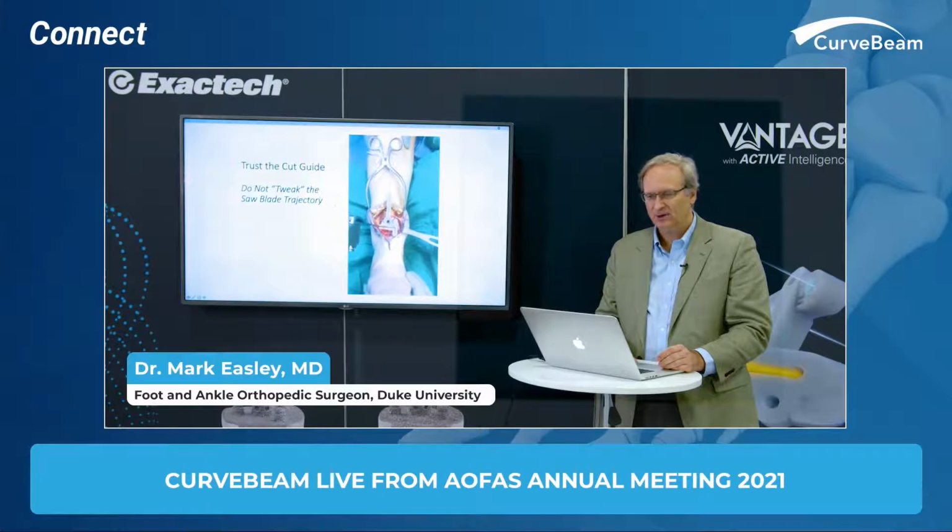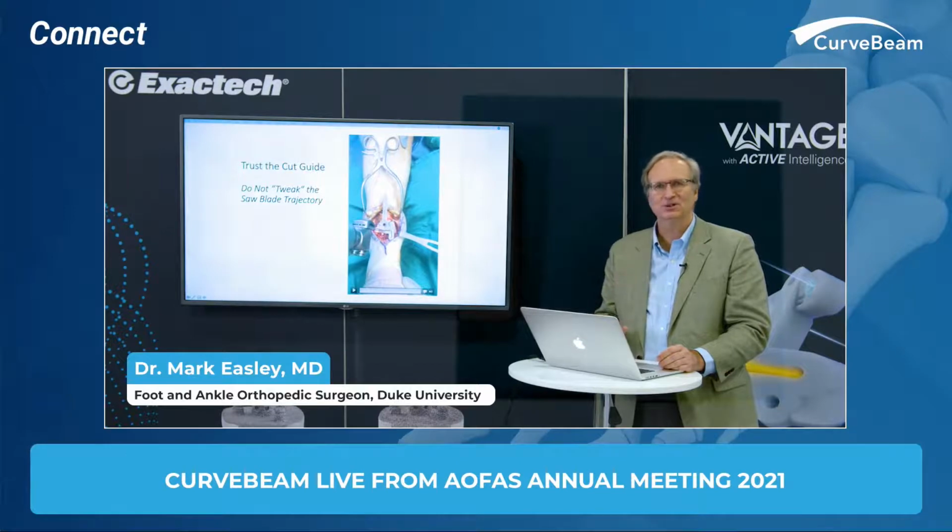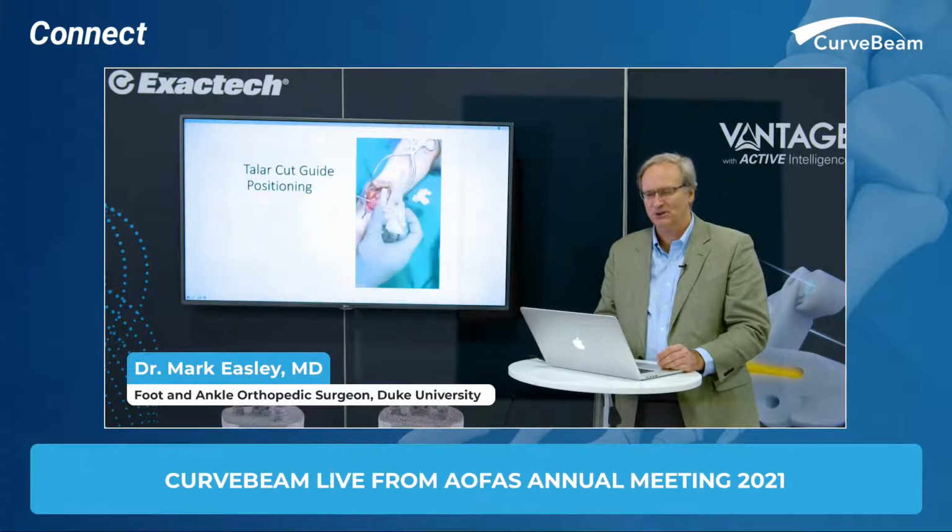And then when I drop this in, I did want to make this point. It is a flexible guide. It's not a metal guide, so we don't want to do a lot of tweaking with the saw blade. And what I'm trying to demonstrate here is it's just a system to trust. It works, it's accurate, and I don't need to do all those extra little adjustments, which I've often done in my traditional surgeries. And then the talar cut guide, I love this.